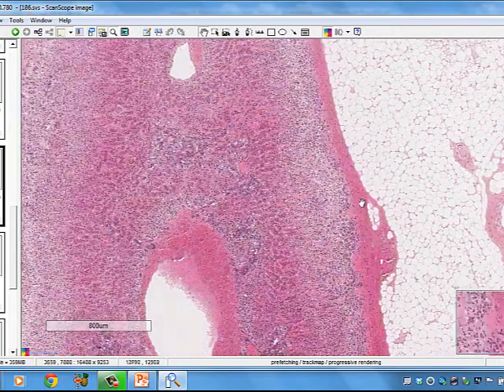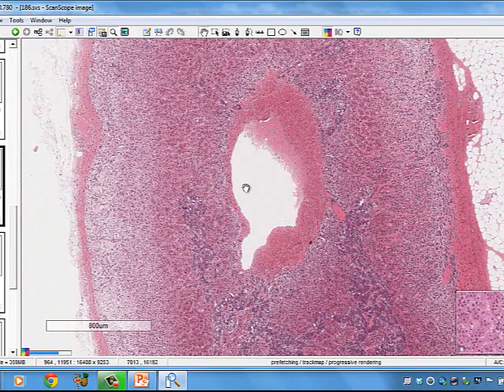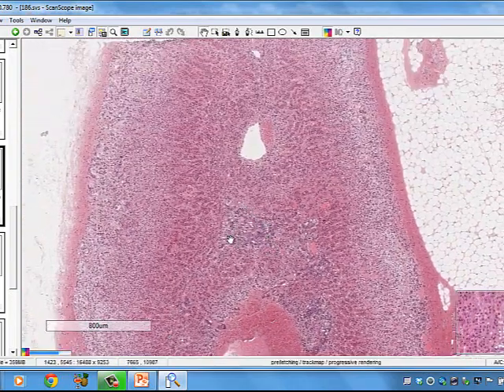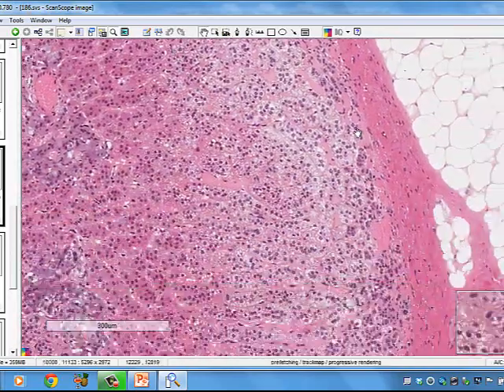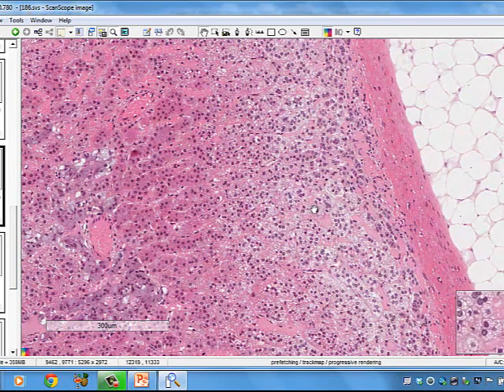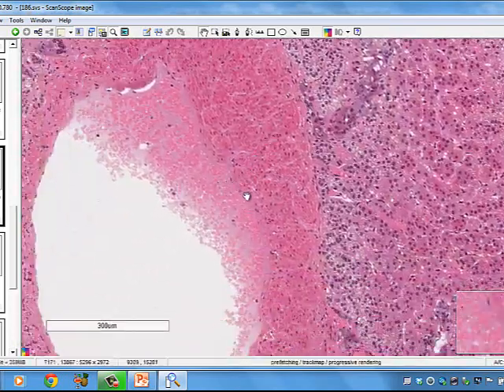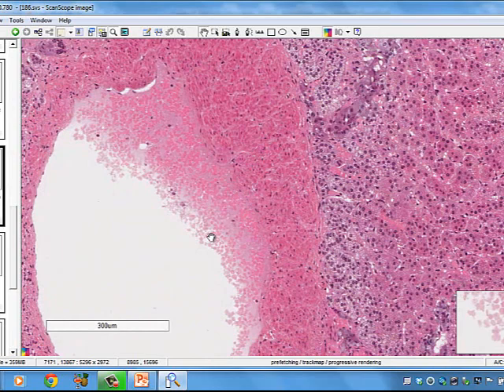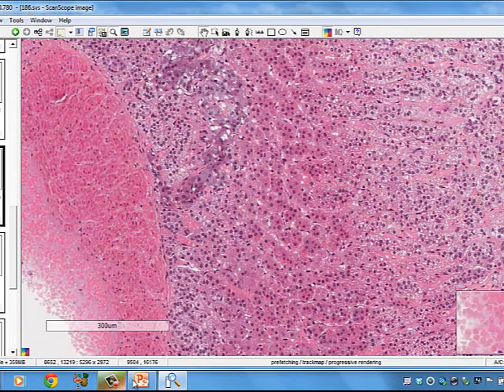So this is the capsule around it, this is the cortex, and this is the medulla. So the medulla is the dark part in through here, the cortex is in through there. And in the cortex, you have the capsule, glomerulosa. Some places look like glomeruli, fasciculata, a lot of vesicles, reticularis, and then the medulla is what we're seeing there, and then blood goes out of the central vein. So blood percolates down through here and then ultimately goes out the central vein.